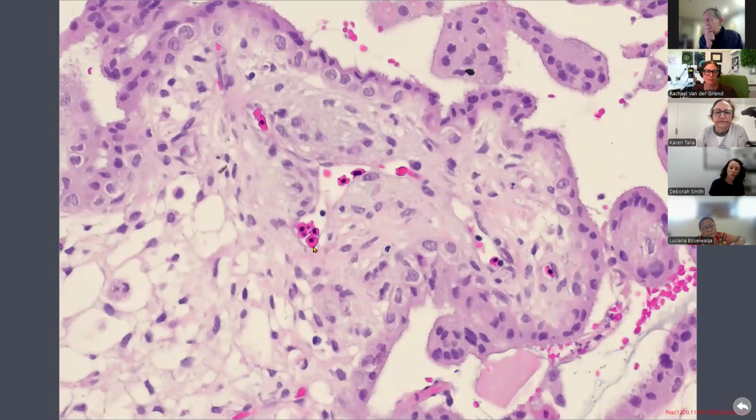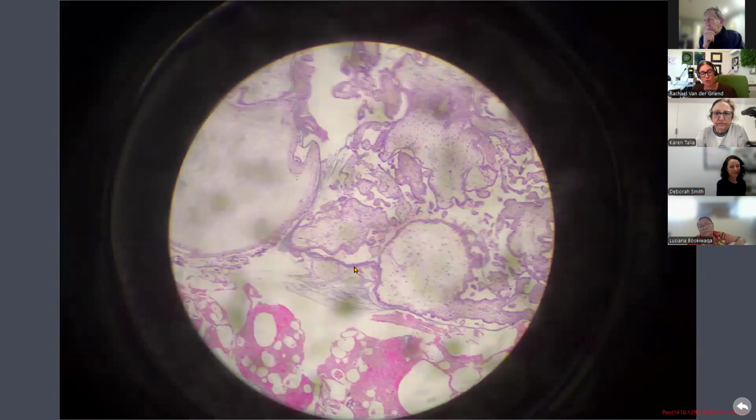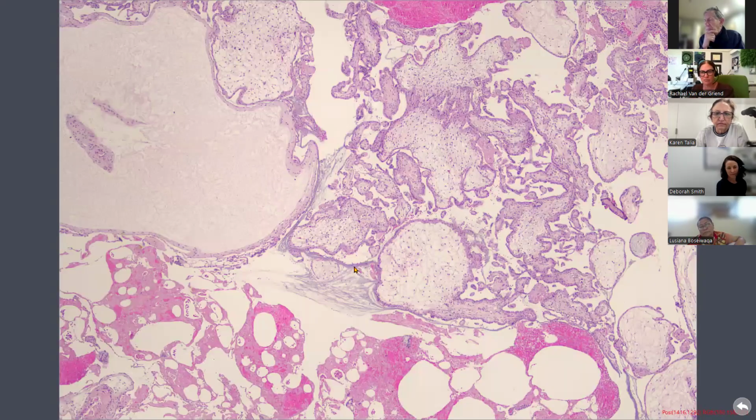It was just very unusual for me because, to be honest, I would have given this as complete without that P57, based on morphology. It showed me that there is definitely an overlap with morphology, which I wasn't as aware of beforehand. I've been caught out a few times. Your P57 was beautiful. In fact, I'll write to you later to find out what clone you use, because ours is really annoying. It's a negative stain, right? It's really hard to interpret sometimes. So that was more curious than anything else.